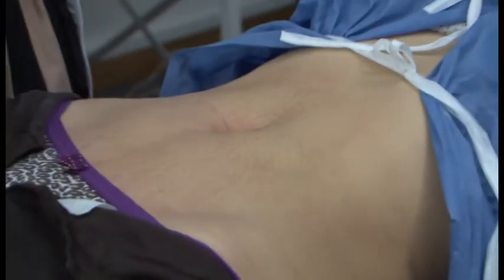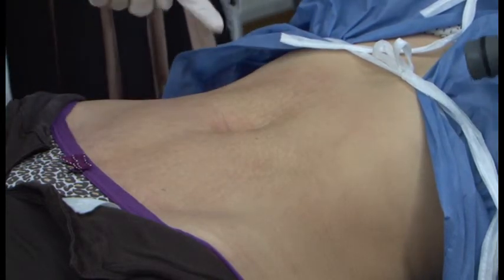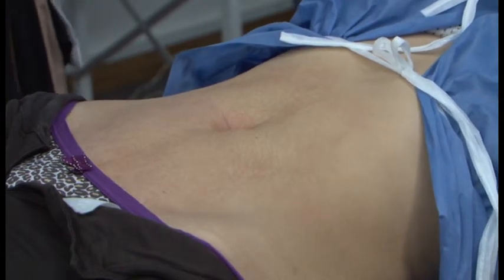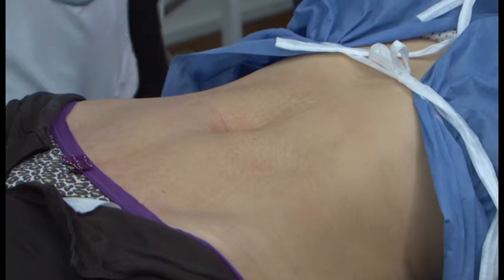Wait a few minutes until the erythema develops. It takes a few minutes, so I wait a little bit and then look again. Are you okay? You're almost finished. I just do 2 more passes here because I want to get confluent erythema. Okay, now go back a little bit. You can see the erythema. Not too much, not too aggressive. The patient is comfortable. The treatment is very, very quick.